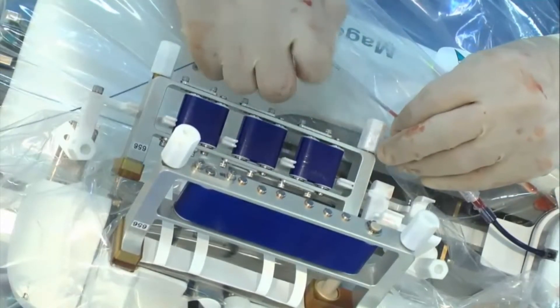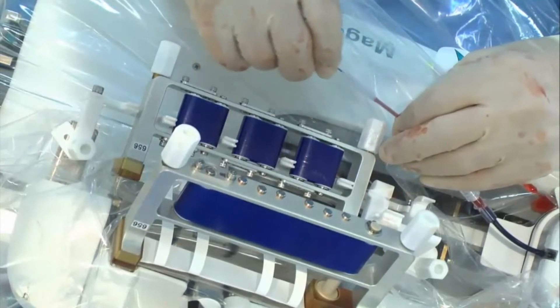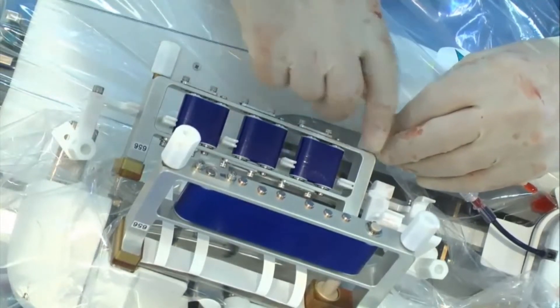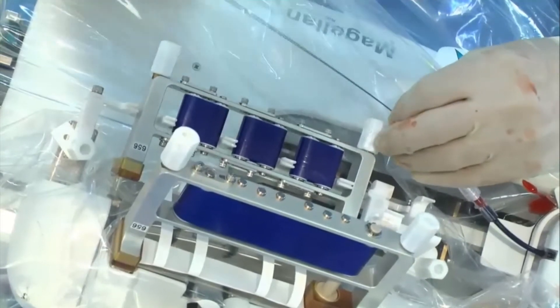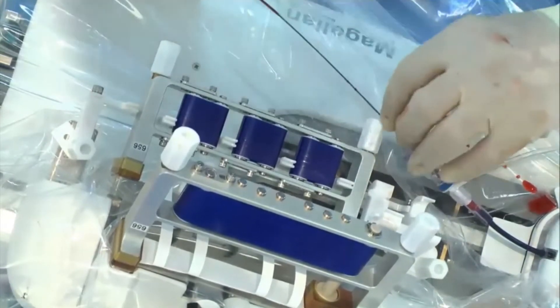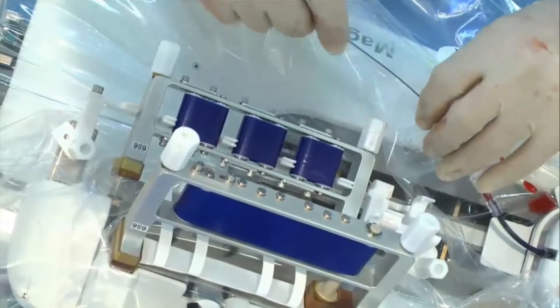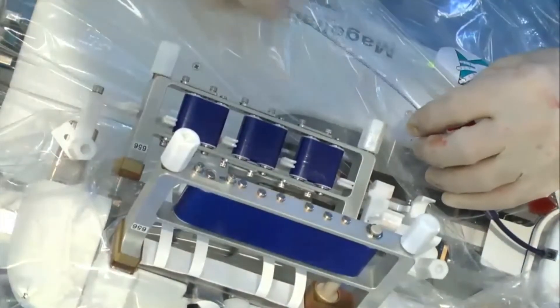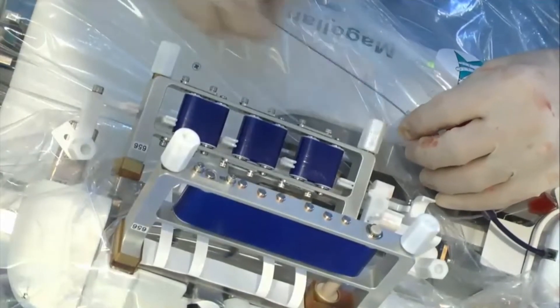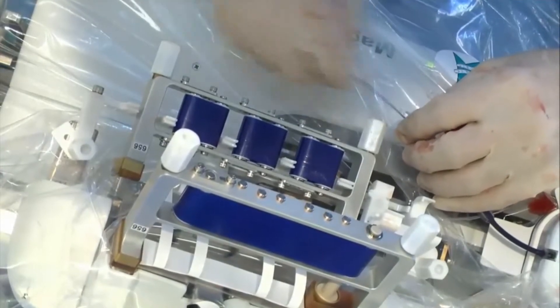So it's all about illumination and magnification and getting your arms resting on a solid surface so that you can use the incredible control you have in your hand rather than your arm muscles. These are really microsurgical principles, but I think they're applicable to some of these more delicate and nuanced endovascular procedures.